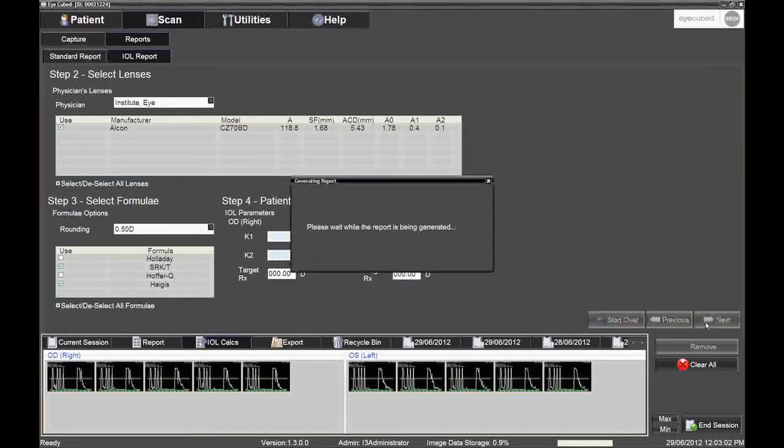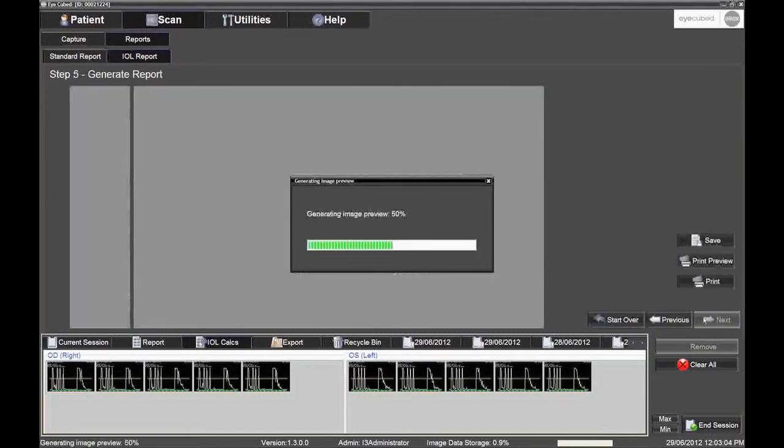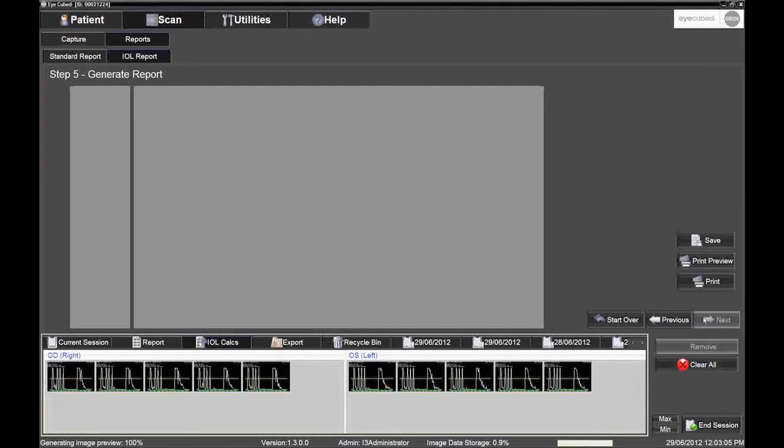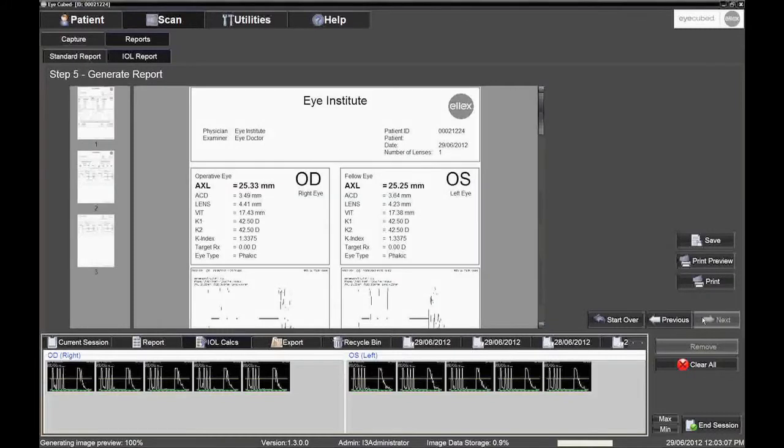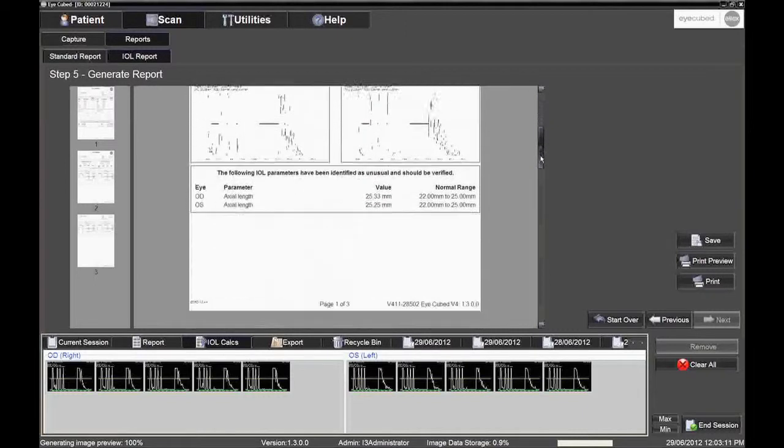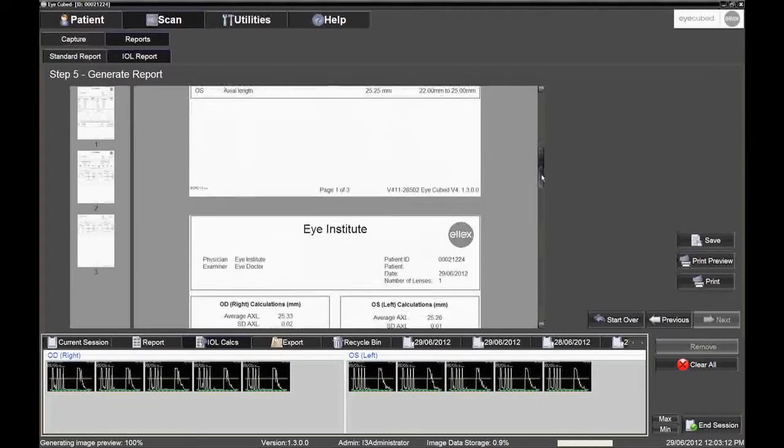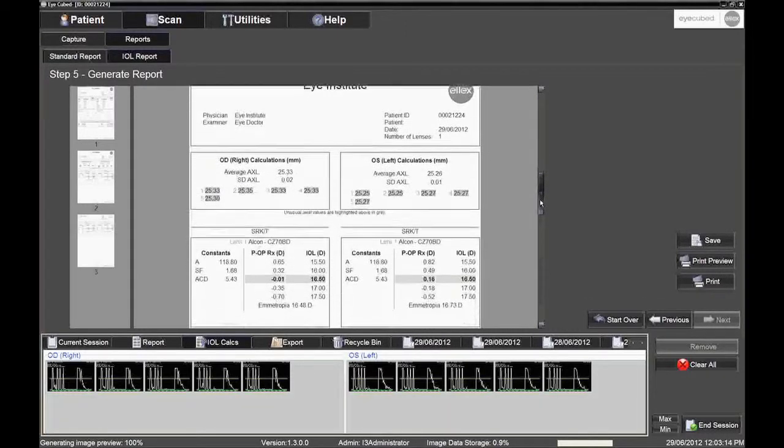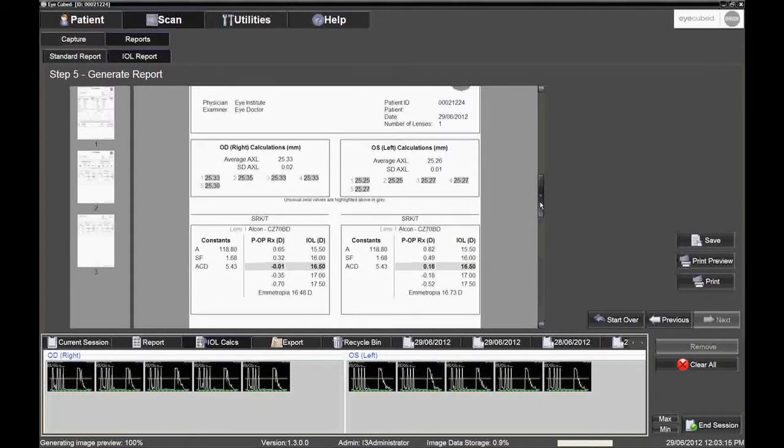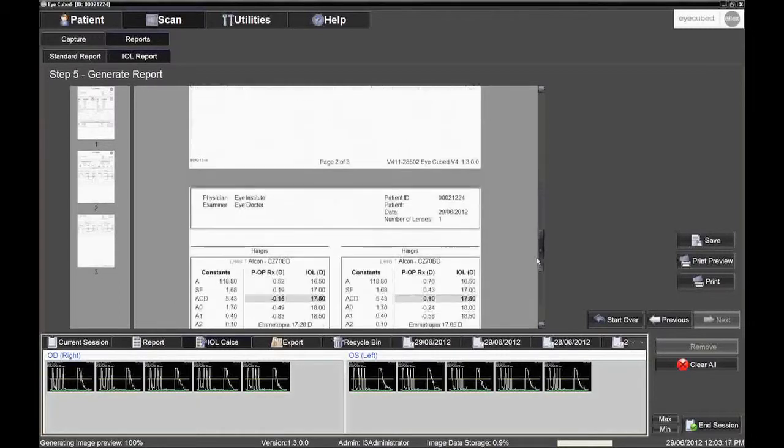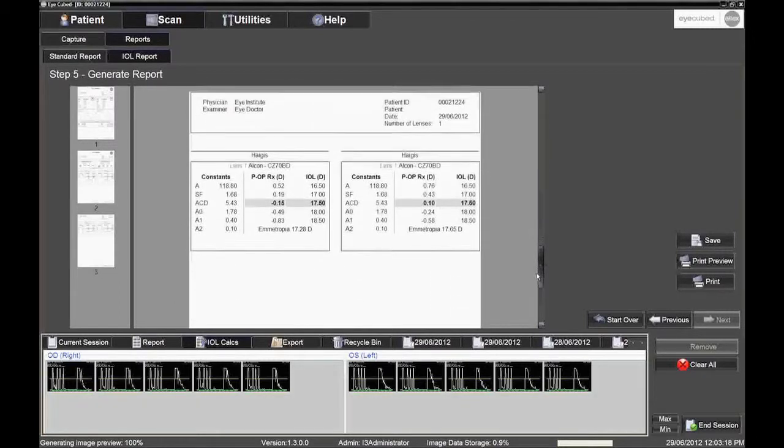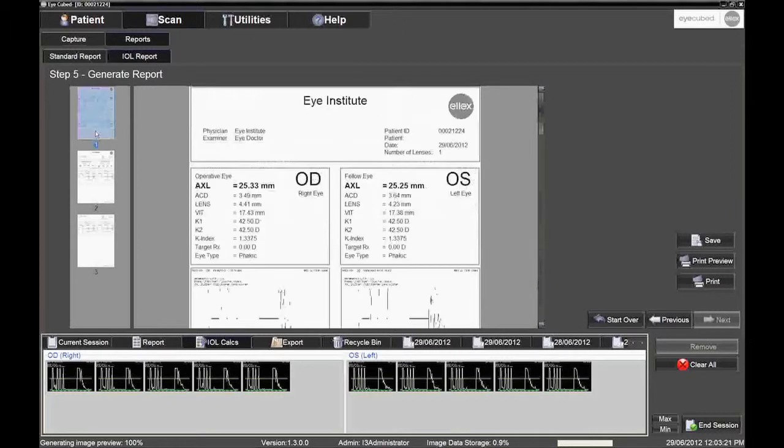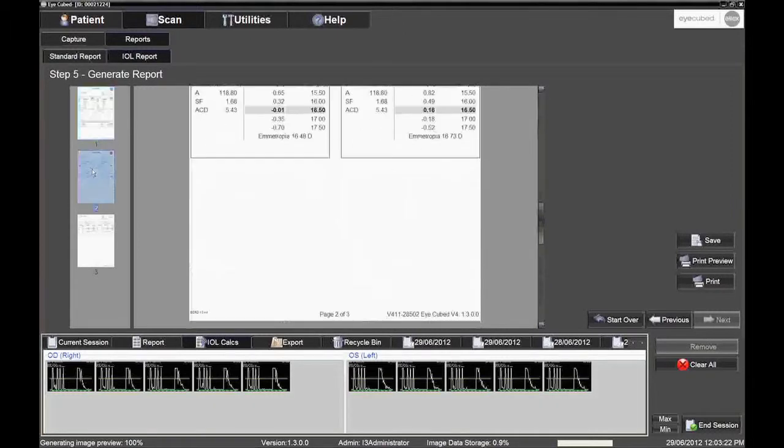Step 5. Generate Reports screen is next. The examiner will see measurements, A-scan biometry patterns and lens calculations for one or more lenses and formulas. Depending on how many lenses and formulas are desired on the report, two or more pages will appear in the tray to the left of the larger report screen.